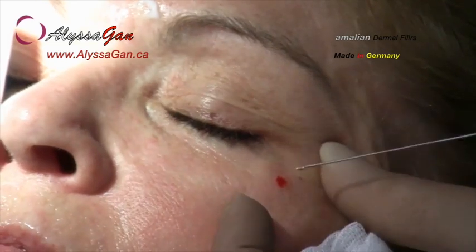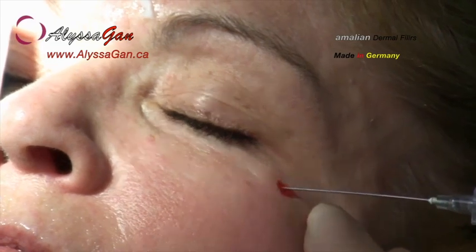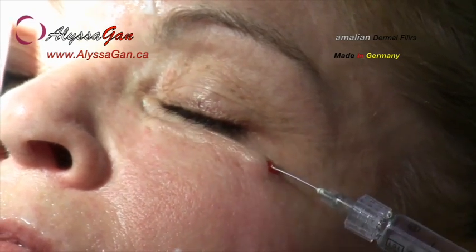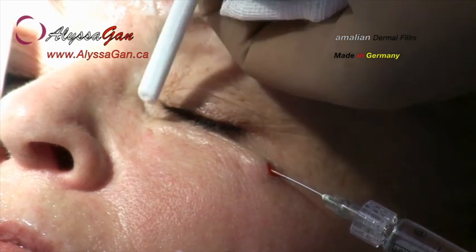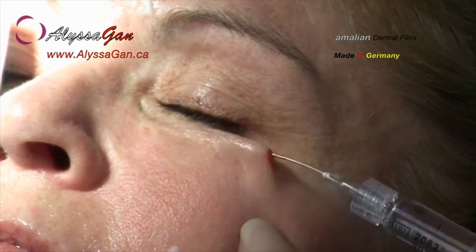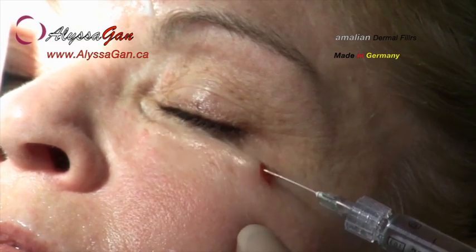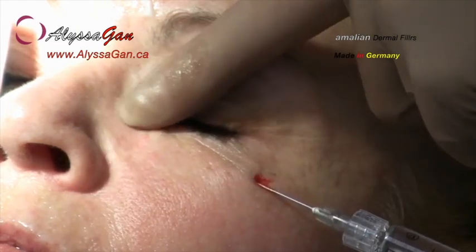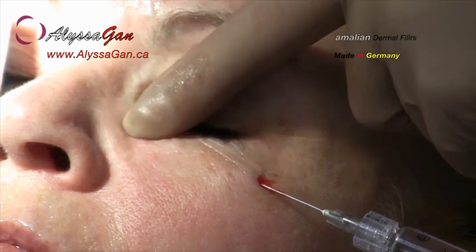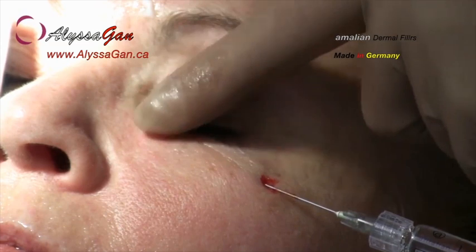By stretching the skin with 2 fingers, the prepared site is opened and the injection cannula is inserted. Again, the exact position of the cannula's tip is constantly controlled by the physician's finger. In the face, principally cannulas with lateral aperture are used. They also have a blunt tip to prevent injuries of the numerous vessels located in this area of the face. Any injury would create a hematoma that would last long and in this way impair the treatment result.